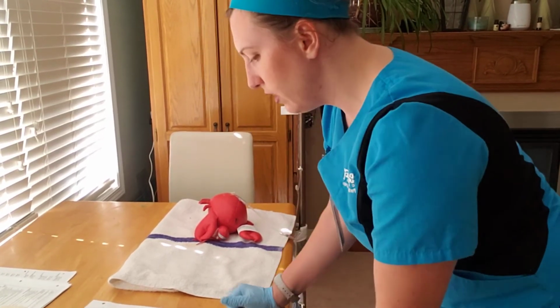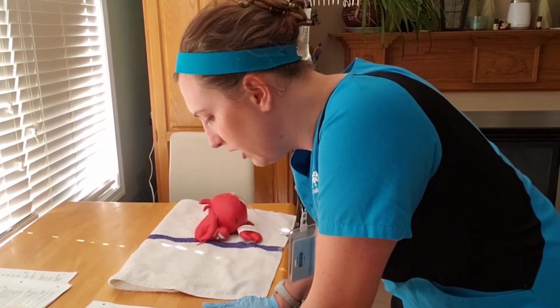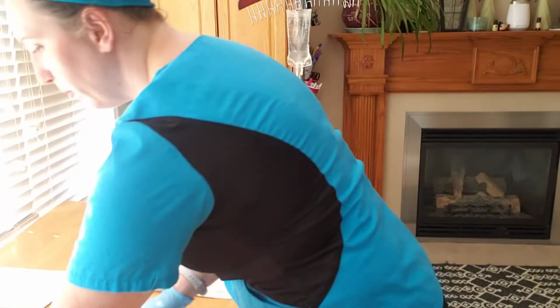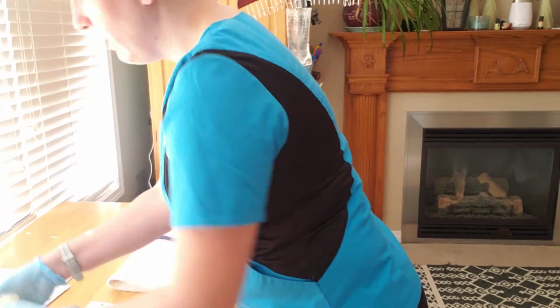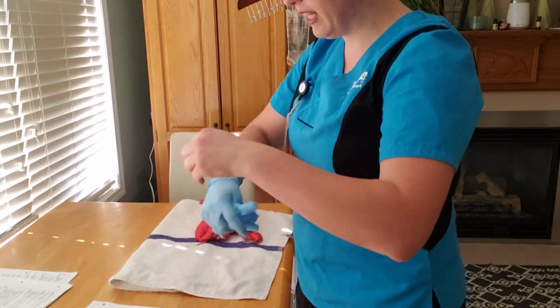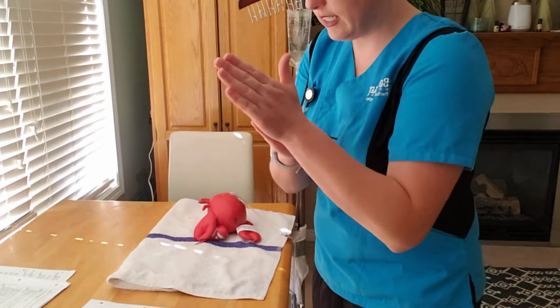So we've got the right route, the right medication, the right dose, the right patient, and the time and date. Okay, so I'm ready to put that vial back in my clean hold. My sharps container's there. At this point, I'm going to take off my gloves. I'm gonna wash my hands.